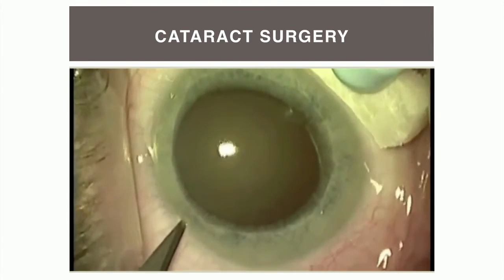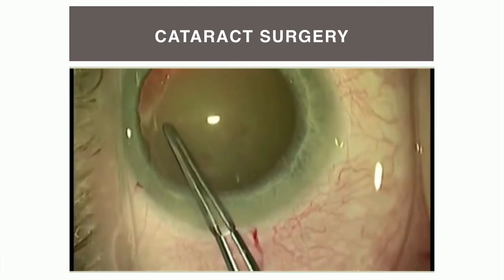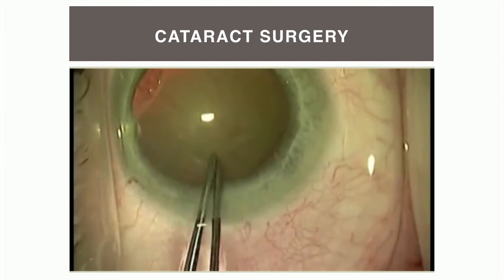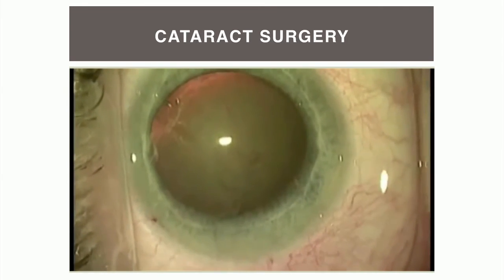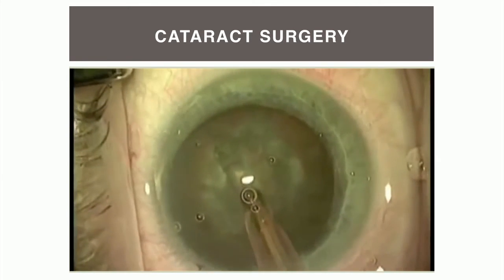So this is a typical cataract surgery. Cataract surgery generally takes about 5 to 10 minutes. This is making a couple incisions in the eye in order to access the cataract. There's a dilated pupil. This surgeon is peeling open a capsular membrane within that sort of M&M complex of the cataract.